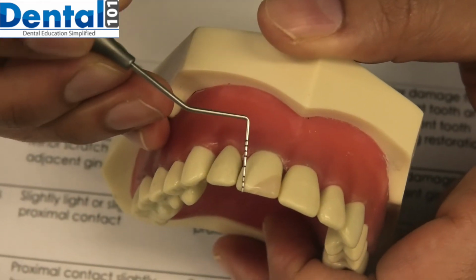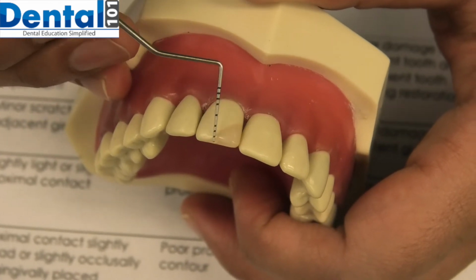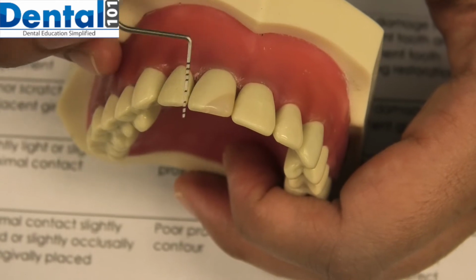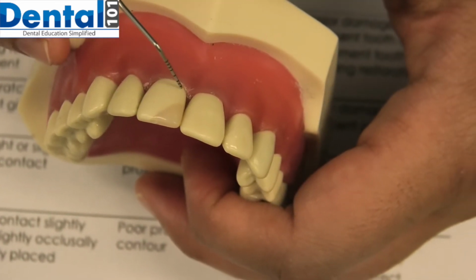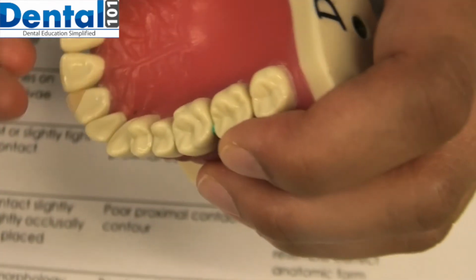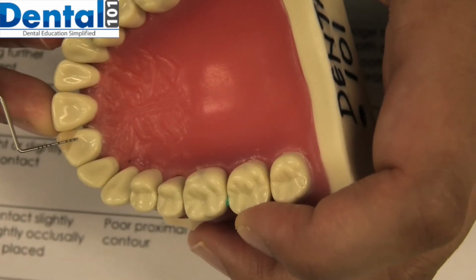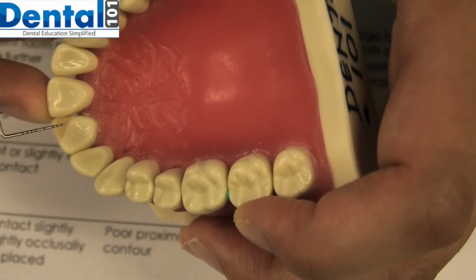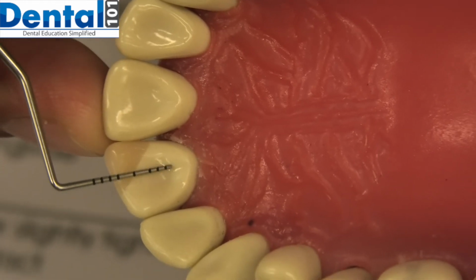So for that, I will check from the buccal side, from all areas, all surfaces, that it follows the tooth morphology. From the incisal edges, it's the same, a bit rounded off, and follows the tooth structure morphology, and from the proximal surface as well, from the buccal and from the palatal side. Again it follows the contours and all the fossae and the depth of the original tooth and the marginal ridge as well, so it follows the original tooth anatomy.